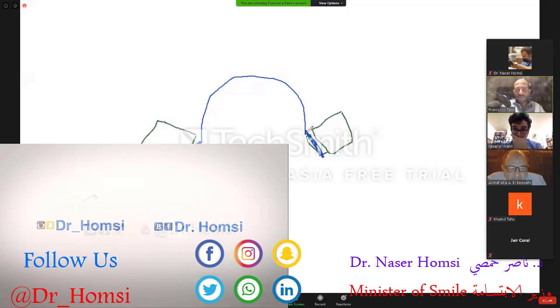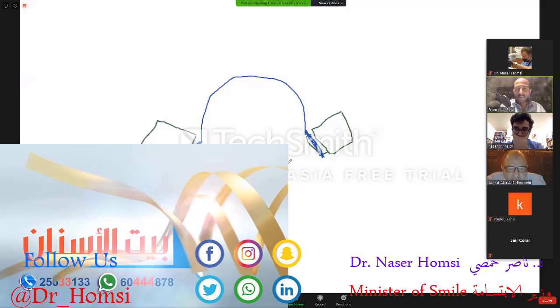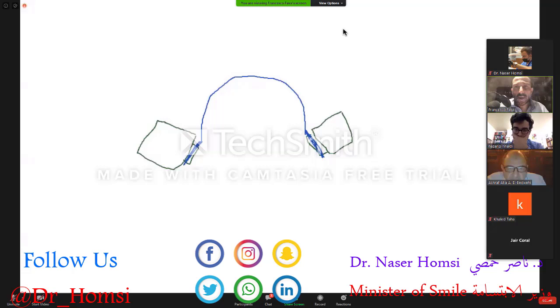Then we can take it out from the patient's mouth and put it on a piece of paper, and then take a pencil and draw a little bar close to the terminal of the transpalatal bar. Then we can insert and activate the transpalatal bar for derotation by activating the two terminals and checking on the paper that the angles are exactly the same.